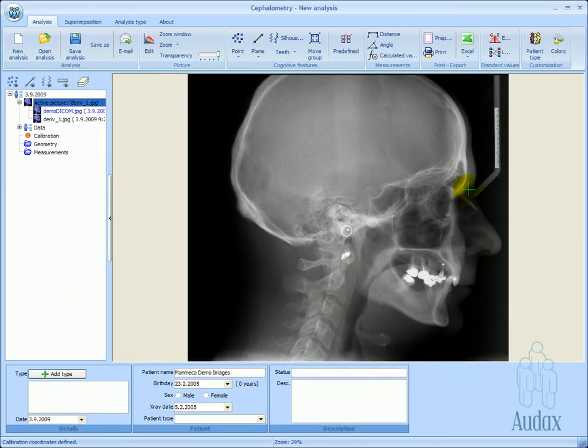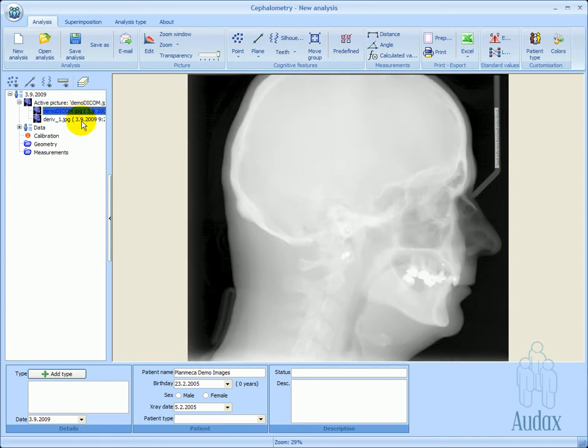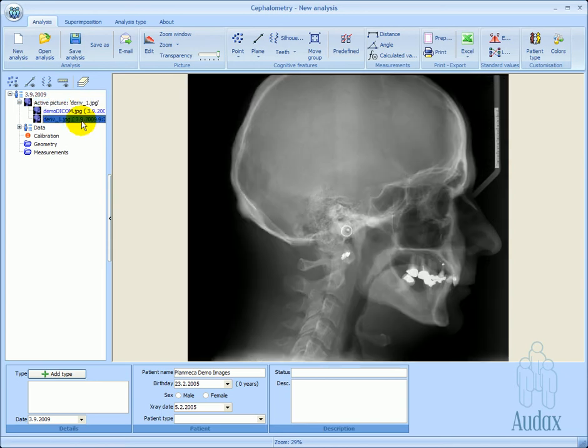We save the image. When the image derivative is created, the original image is still part of the analysis. We can use the tree structure to switch between the two pictures, and use them both in the diagnostic procedure.